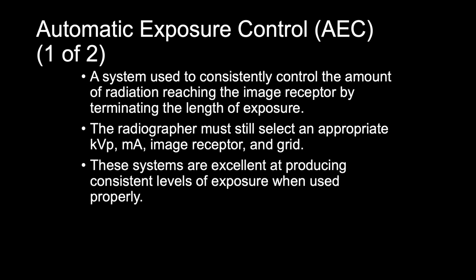Even though we have these technique charts, and even though the machines are calibrated for each exam and already have the technique set in the control panel, we still have the ability to increase and decrease our KVP, our MA, our exposure time, and anything necessary that we need to adjust depending on the patient's size, the patient's age, pathology, all kinds of different reasons.